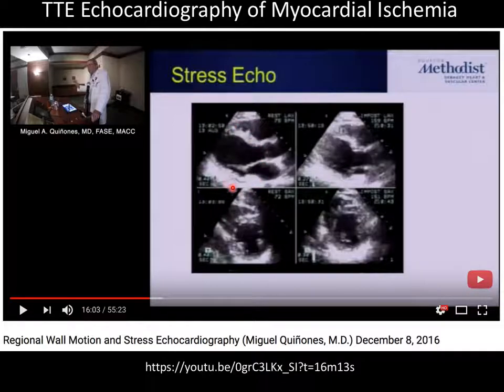So you actually look at the parasternal view of the patient at rest and during stress, and you look at them side-by-side, and you ask the question, is the one at stress any different, other than the fact that it should be contracting much more vigorously, right? So that's how it's done. They literally put them up side by side, the rest and the stress, and they ask that question, right? And so they'll do it in different views, in the short axis view and long axis view.